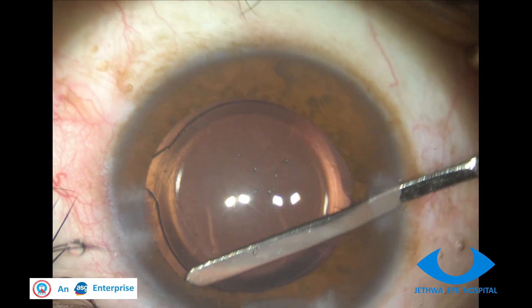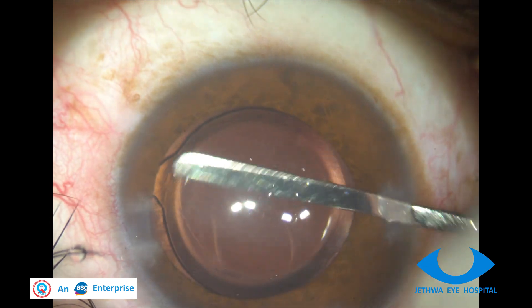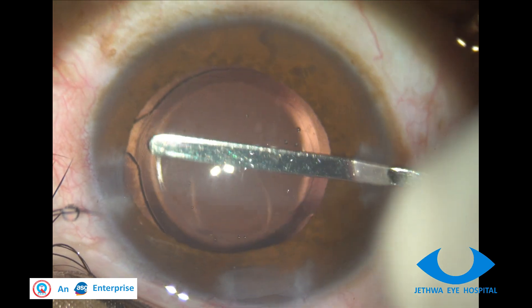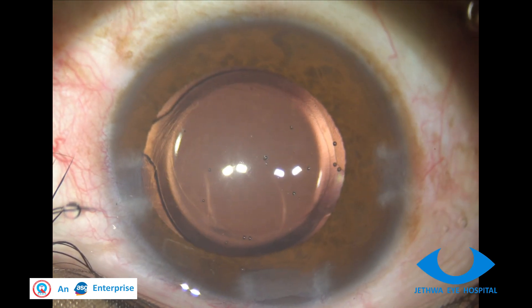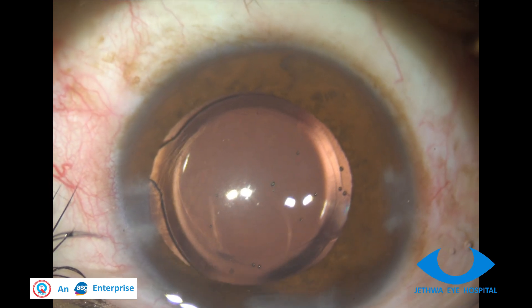This is a confirmation of any vitreous in the AC by swiping the iris repositor. Once it is confirmed there is no vitreous in the AC, we proceed.